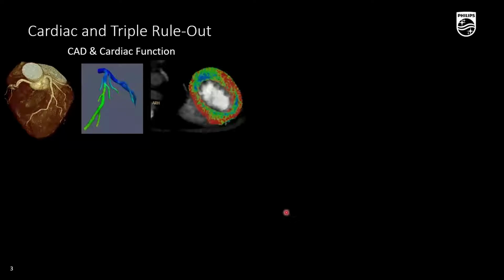Where is it used right now? For example, cardiac applications, looking at coronary artery disease, assessing with an iodinated contrast agent to see the vasculature, to see if there are any narrowings of the arteries, any blockages of the blood flow. There are developments looking at fluid dynamics to try to get an assessment of blood flow through the vasculature. Not really the first choice at the moment, but it is becoming more popular, or we're seeing the potential, is with myocardial function. So looking at perfusion through the myocardium, extracellular volume, things like this.